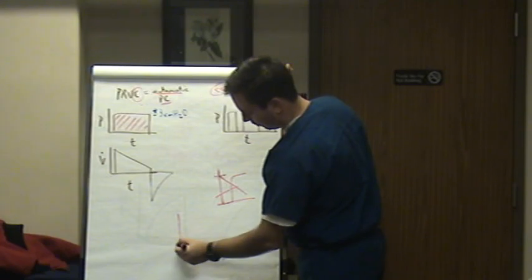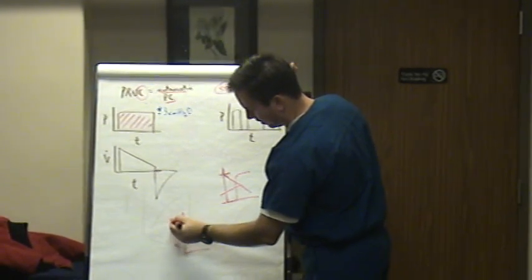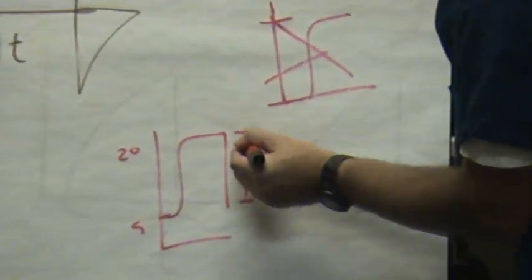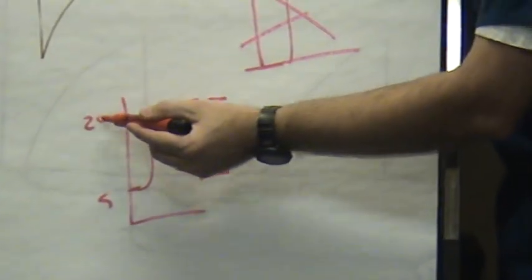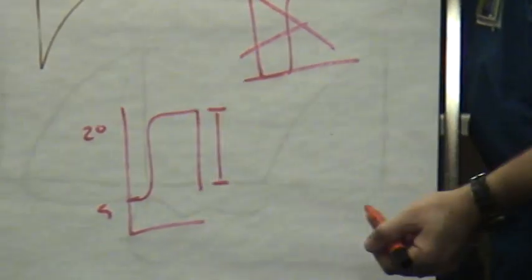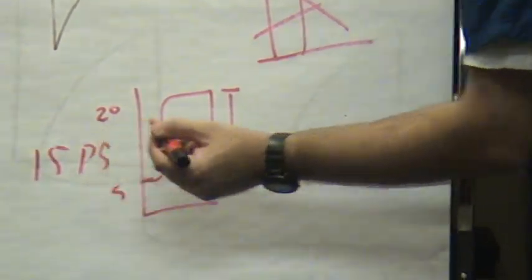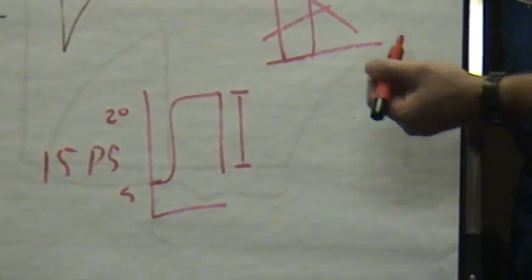If the patient is on 5 of PEEP, and let's say that your peak pressures are 20, what is my delta? What's my pressure difference between the breath, from the PIP down to the PEEP? So it's taking 15 of pressure support to help this patient right now in volume support. You walk to your next patient.